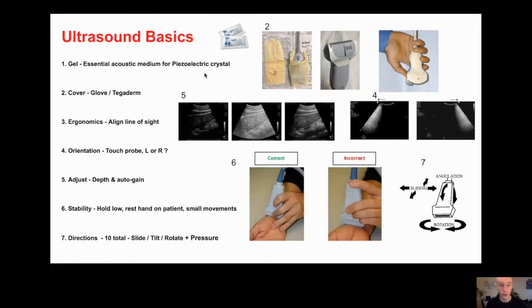Don't do it. They'll tell you that you don't need it. You absolutely need a probe cover. In Edinburgh, there was a patient that got hepatitis from the patient next to him because the ultrasound machine was taken to do a cannula and then another cannula. Blood must be cleaned with the appropriate cleaning solution, and it never is.